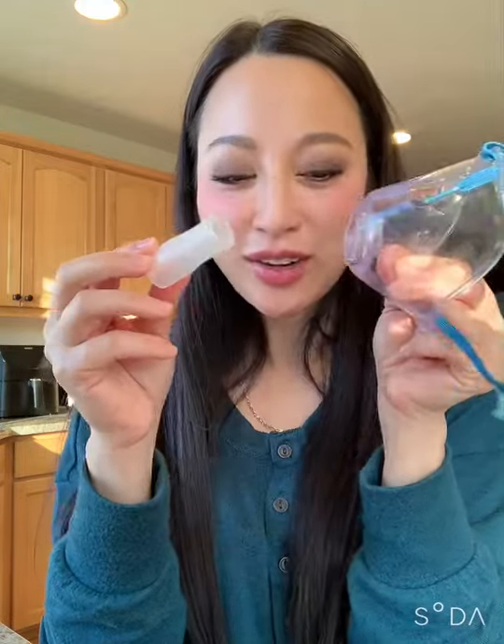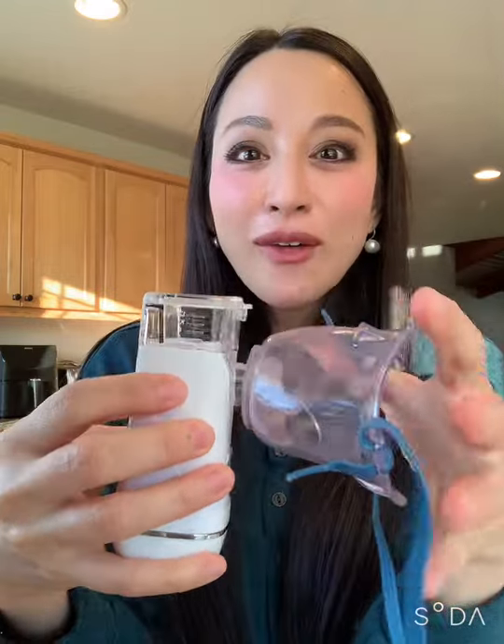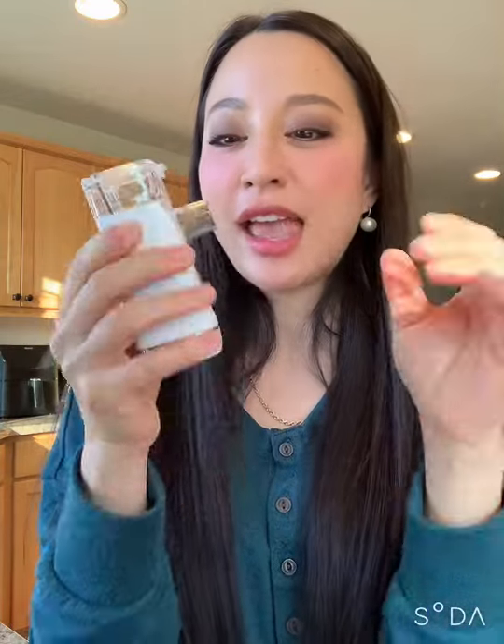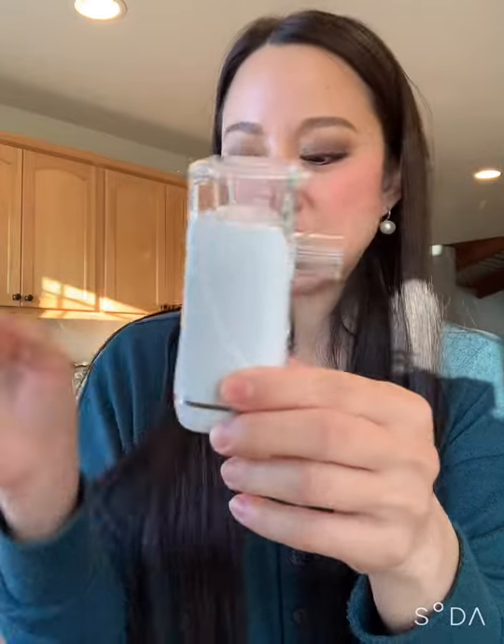I'm so embarrassed. I'm not going to delete my former video and start all over though. You actually just put the mask on like that and it stays. However, the folding just did not work well.